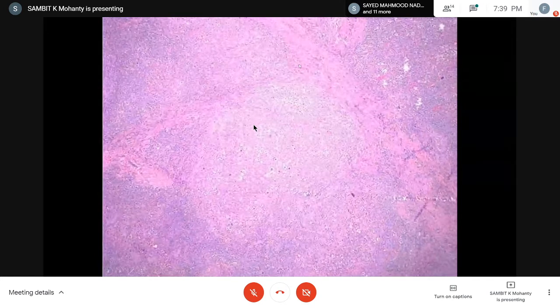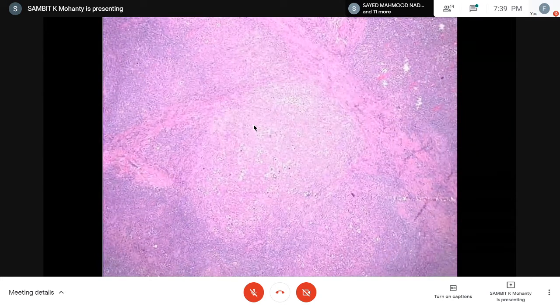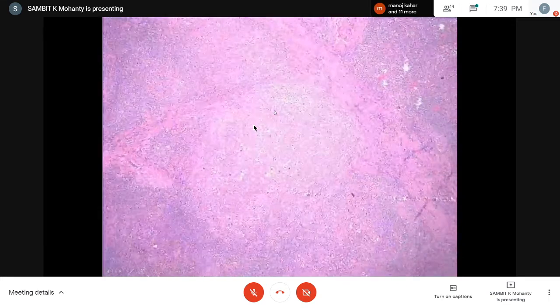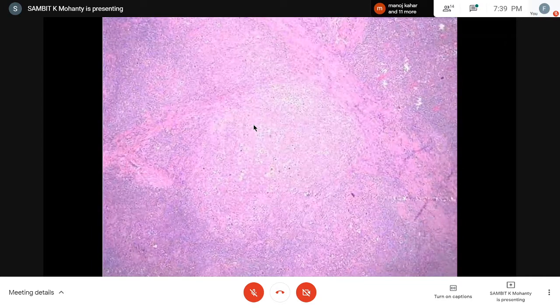And this is the paler nodule. You see these big cells from this far as well, and some small cells. This is more mottled. What I mean by mottled is they have shades of white and blue, or pink and blue, and this is like a blue area.